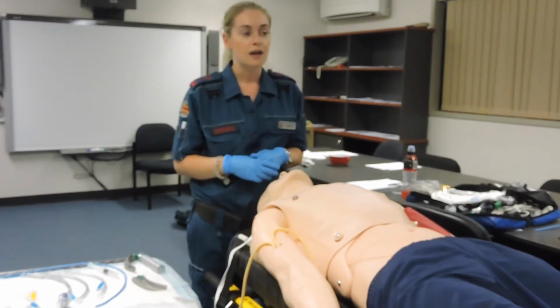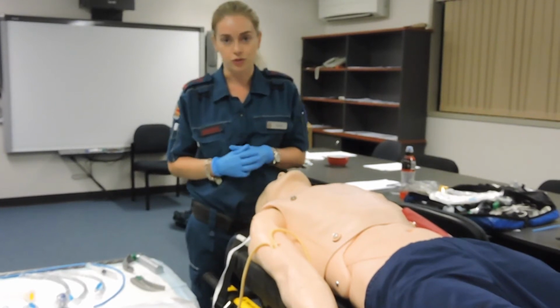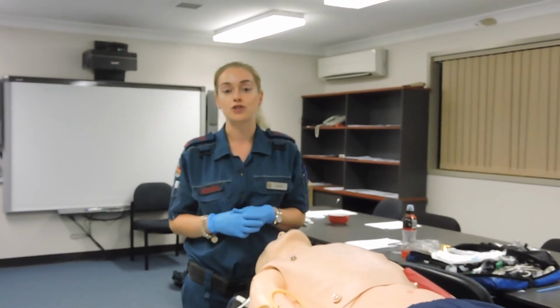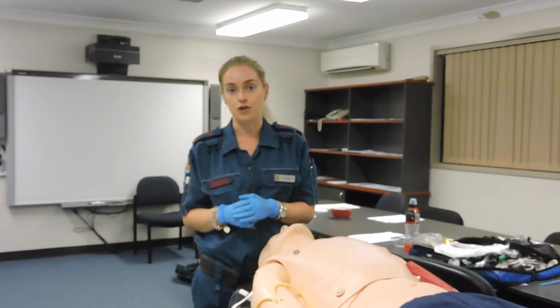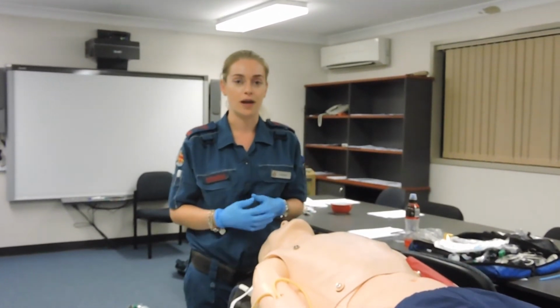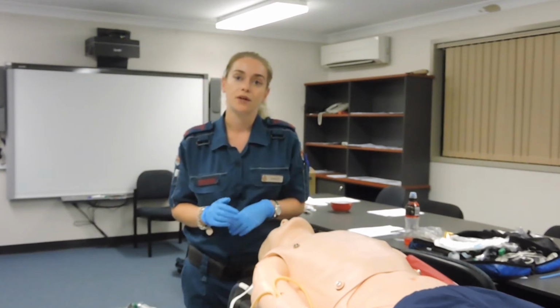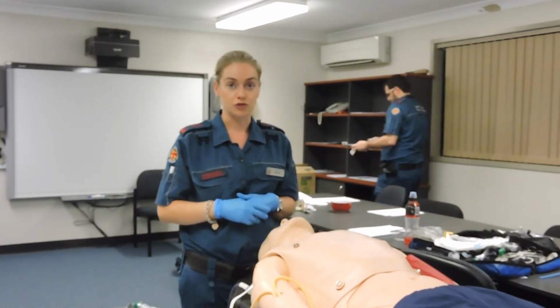For the purpose of this video, QAS CCPs do not have surgical airway except for the HARU trained CCPs. As a result, we don't stock surgical airway kits at the stations available for use. So for the purpose of this video, I won't be able to demonstrate a surgical airway. If I can ask my airway assistant to come forward, we're going to go through a failed intubation drill.